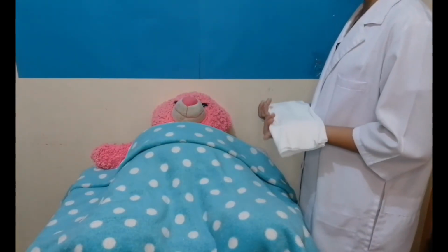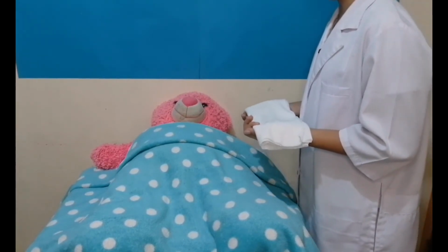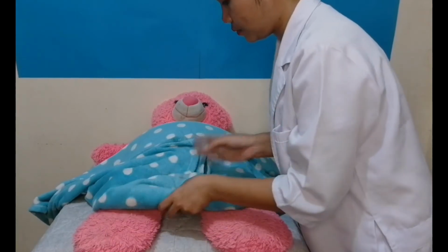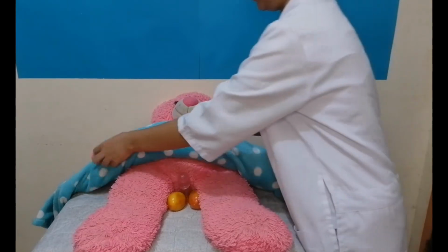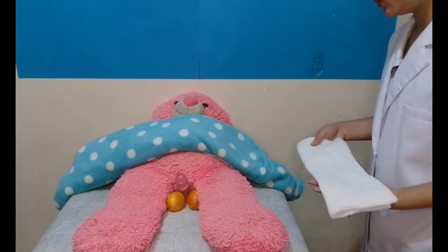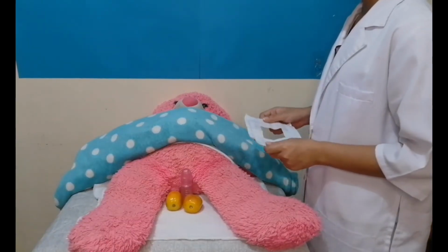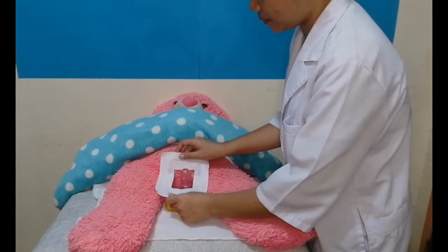Then after that, sir, I will expose your private part. Then I will put an underpad with a drape. Underpad na po. Then after putting the underpad, sir, I will put the drape na po, sir, ha? Relax lang po.